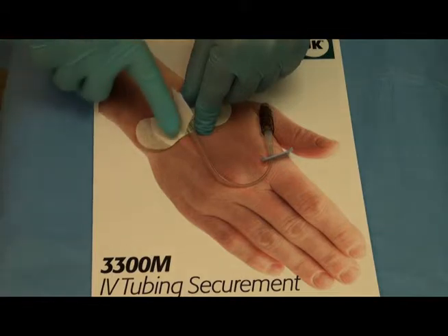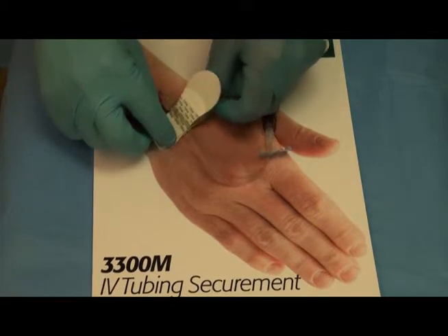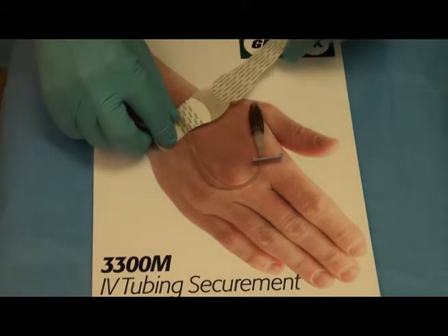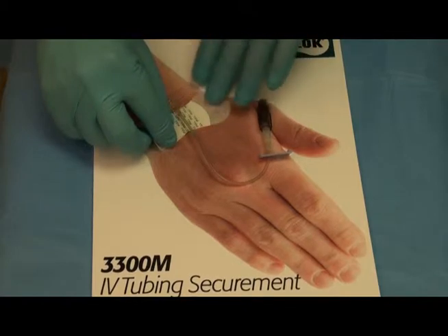While holding the Grip Lock and catheter in place with one hand, remove the bottom release liner from one side and adhere to skin. Then remove the other bottom release liner and secure that side to the skin.